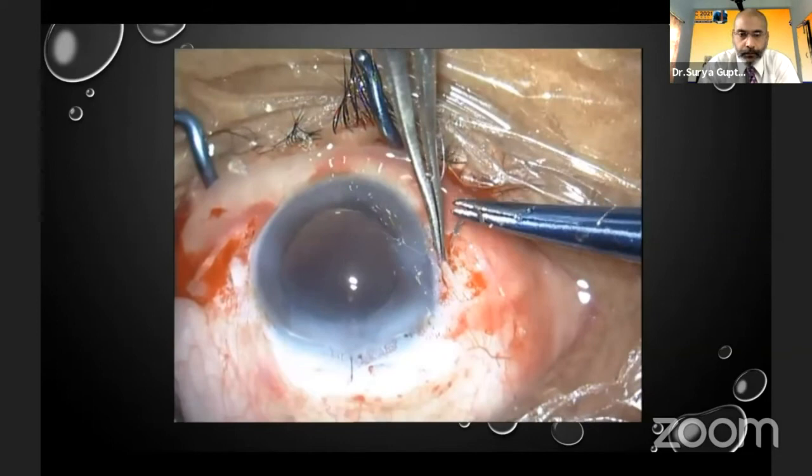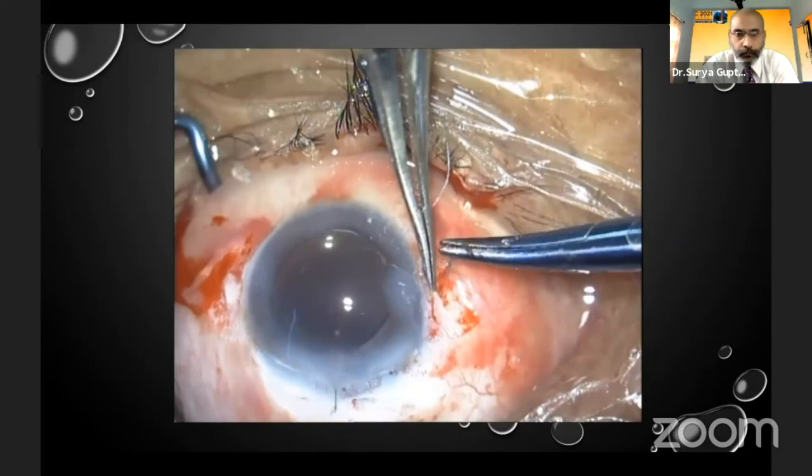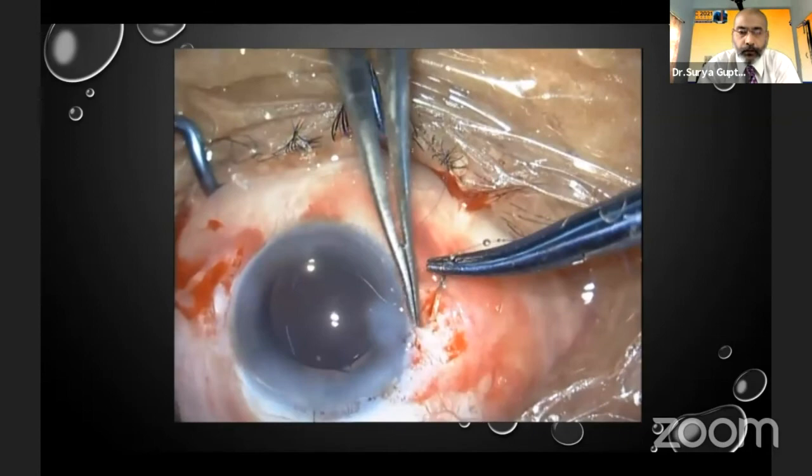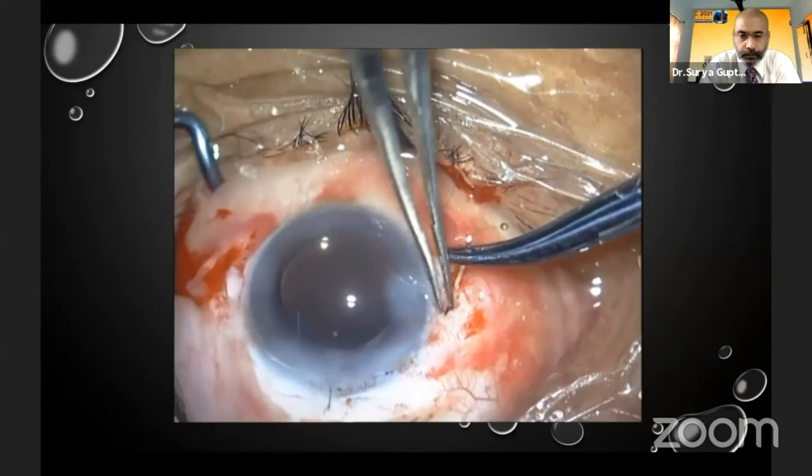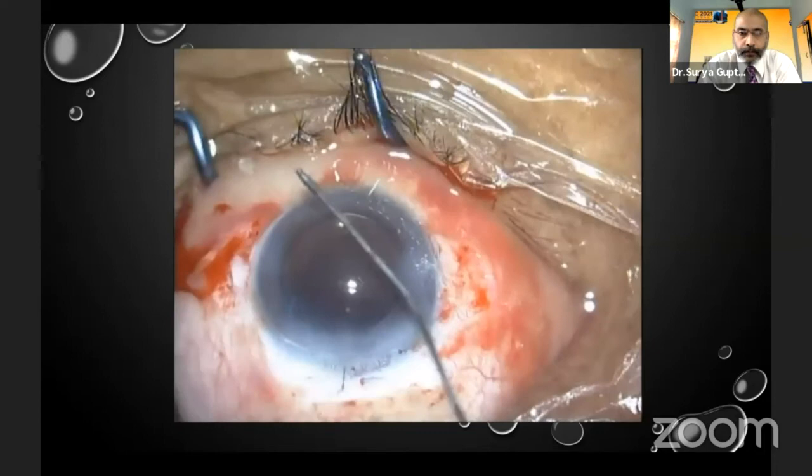So now I don't know how stable the lens is. I try to tap the lens up and down just to make sure whether it falls down or not, whether there's any movement, because I can't even free the lens. It's already a triple knot is already there. So I can't free the lens. If I could free the lens, I could take the haptic out, re-suture and go on again with a fresh shot of scleral suturing. Thankfully, you know, fortune favors the brave and the luck was on my side. So the lens is fairly stable.